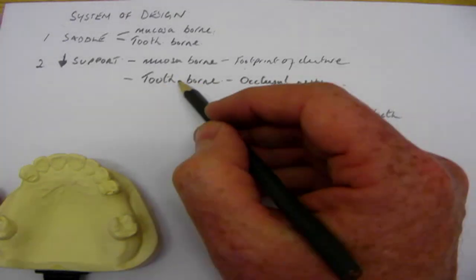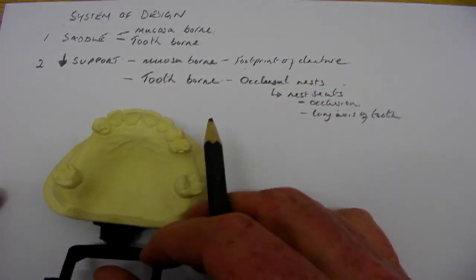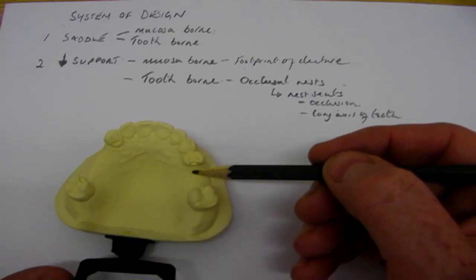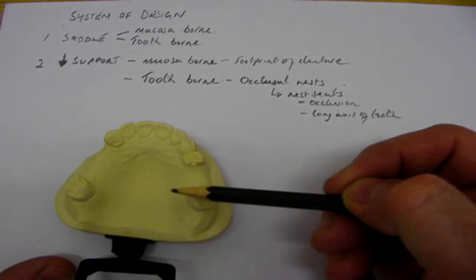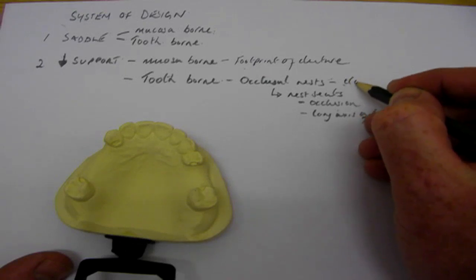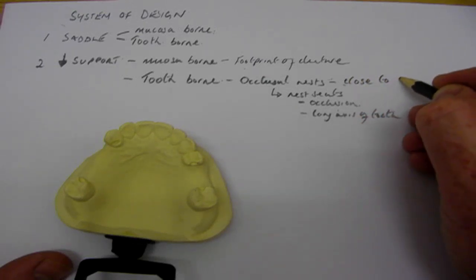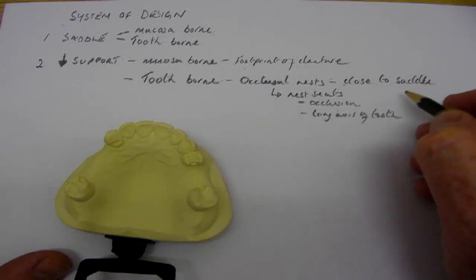And when we're designing occlusal rests, or deciding where they should go, there are a couple of very simple rules. So if we have bounded saddles, such as this case, which is purely tooth borne, then we put the occlusal rests as close to the saddle area as possible.